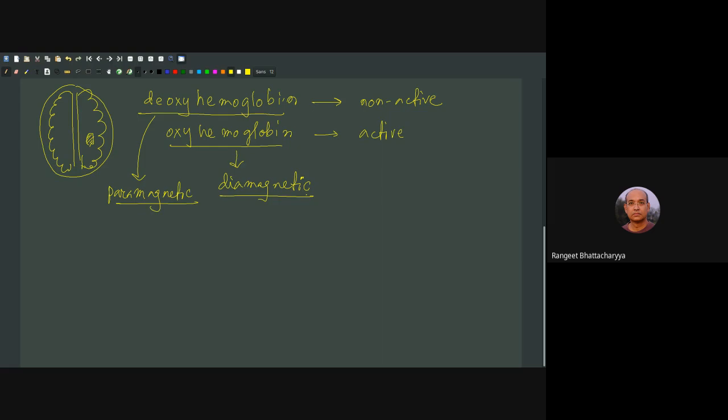What's the difference, I mean, how does it affect us, the paramagnetic or diamagnetic? Okay, it's simple. For example, if you have a tube and we have our spins, just imagine inside, suppose we have a paramagnetic ion here. Usually you see these are nucleus spin, and the paramagnetic ion is basically electron spin.